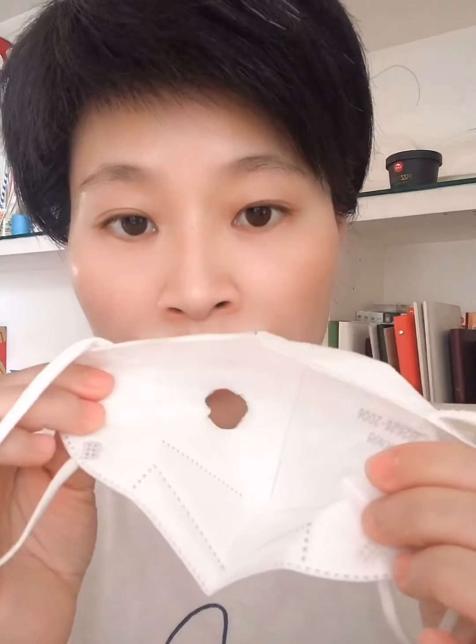Today we are going to DIY a KN95 mask with a valve. First, we take one mask, then we cut a hole. It's about 25 diameter. Okay, so now I've made the hole already. It is not so wrong. Then you can draw it, then do it.